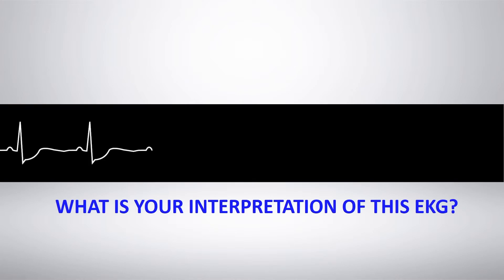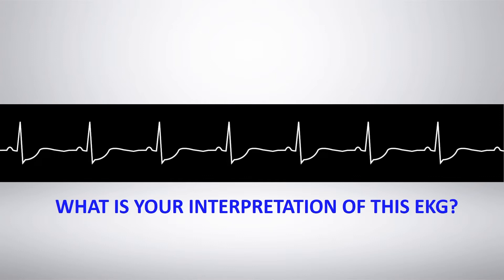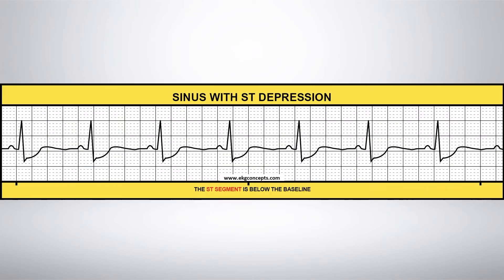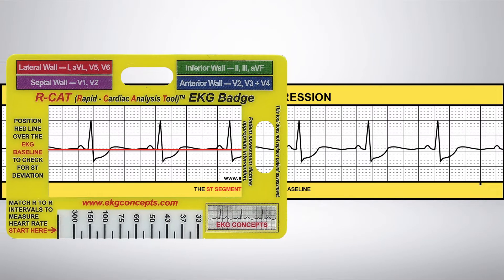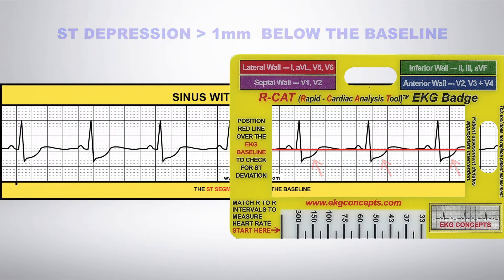What is your interpretation of this EKG? Sinus with ST depression. Let's use the EKG badge to interpret this rhythm. Align the red line of the badge with the baseline and slide it along the rhythm strip looking for ST deviation. Here, you have ST depression greater than 1 mm below the baseline.